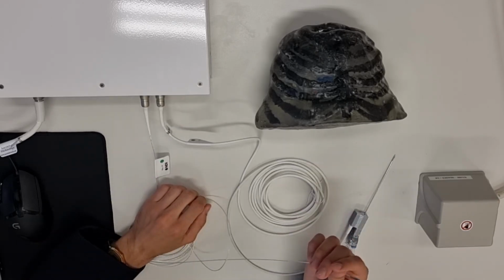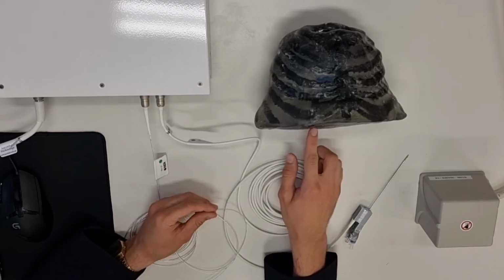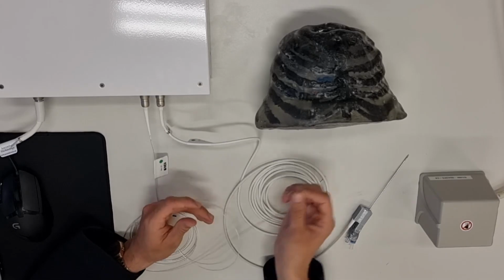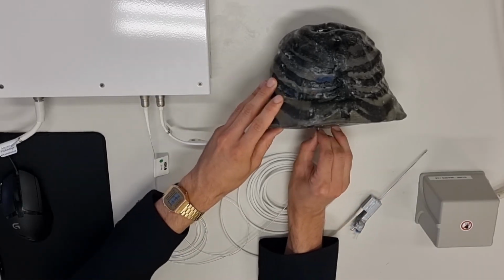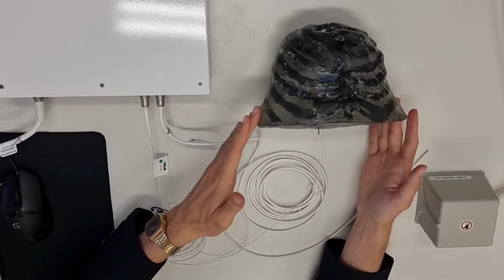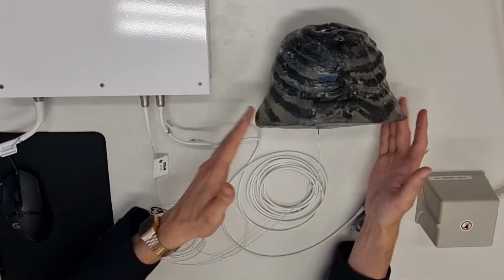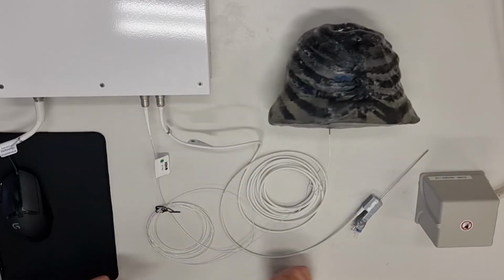So we fix it to the patient. On our patient here, we have a spot that doesn't move when breathing, so we put it here in the back. This is a part that doesn't move. So this makes the whole system agnostic to patient translation and rotation.